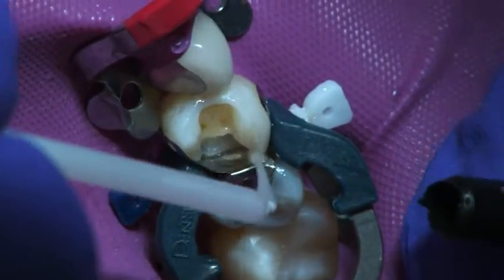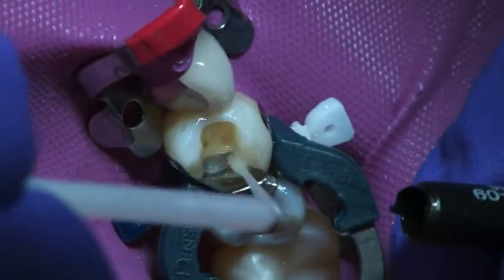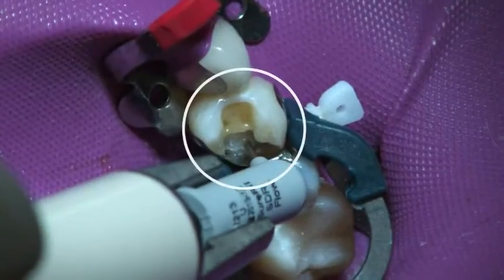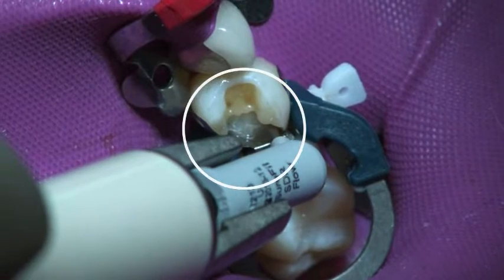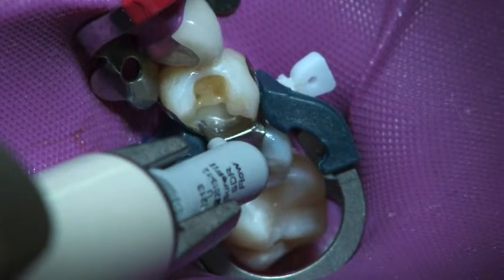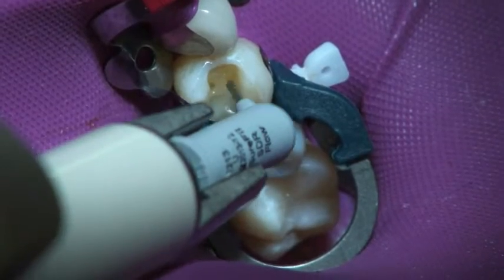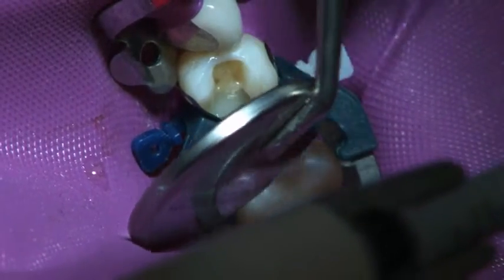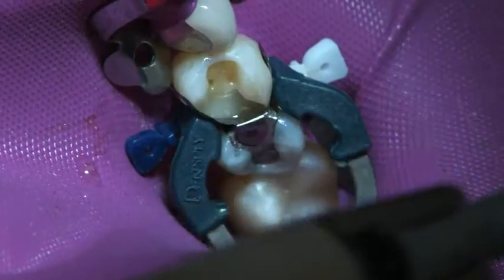Now, after selective etching and bonding with Zeno 4, we're ready to bulk fill with Surefil SDR Flow. Notice here the depth of the prep, which makes it an ideal candidate for Surefil SDR Flow. It can bulk fill up to 4mm — I don't have to layer — and it'll adapt well to the matrix and cavity. Its ability to bulk fill to 4mm alone makes it an ideal companion to the Paladent Plus system.